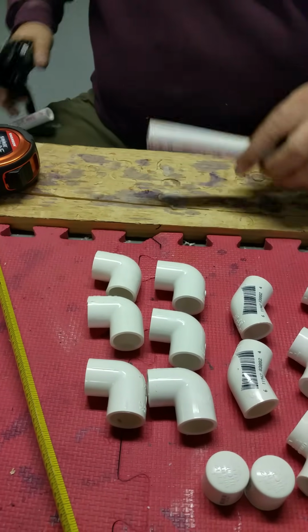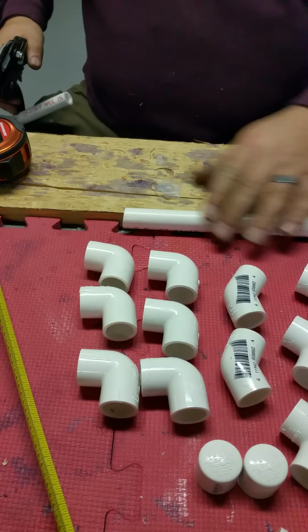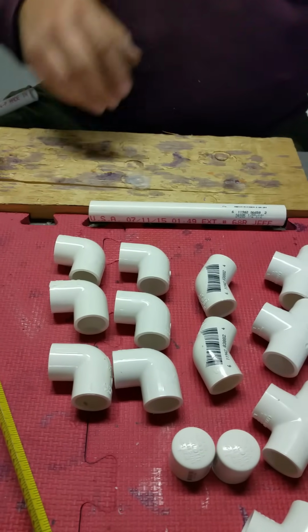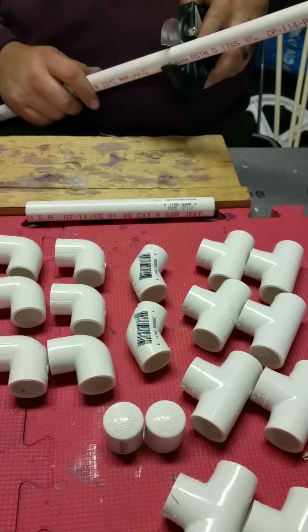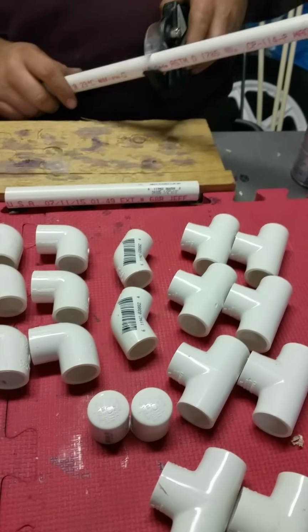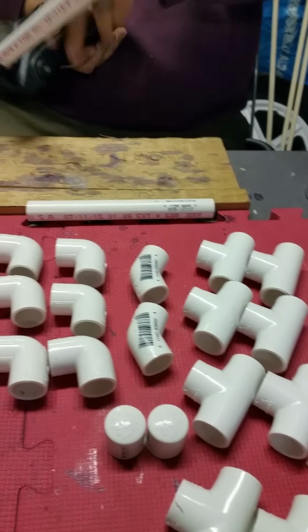The width of the cart is used for the top back rail and is also used for the belly bar, so you can make 2 of those. The belly bar adds extra support to the cart and helps stabilize it.